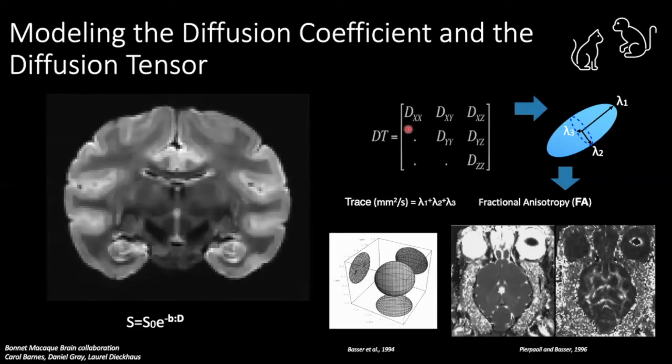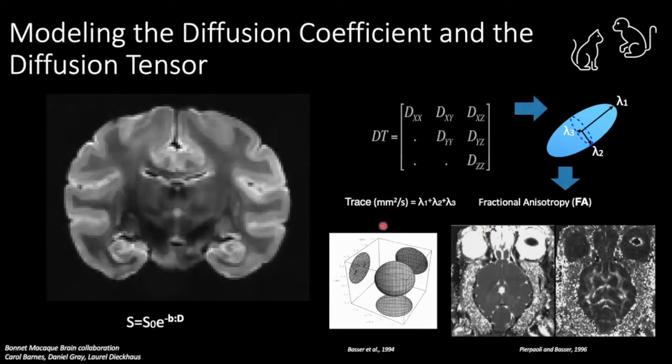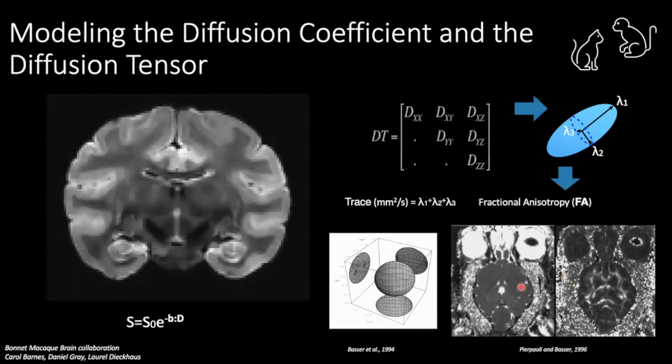And of course, we get the diffusion tensor, which is in the scanner reference frame, and we can get our eigenvalues and take it out of the scanner reference frame and come up with a number of metrics that tell us about the three-dimensional magnitude and shape of water diffusion, in a very basic way through the diffusion ellipsoid. And we use these fractional anisotropy and trace or mean diffusivity maps to characterize that.